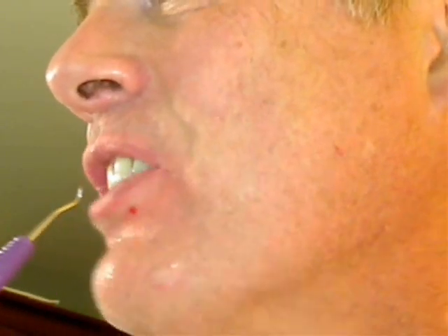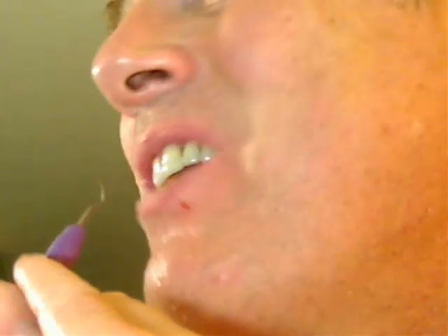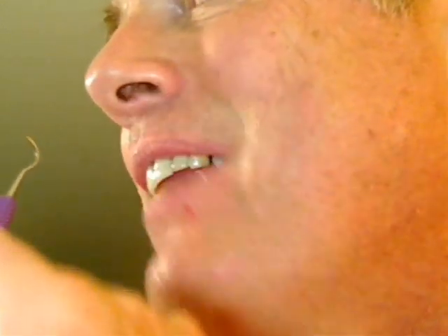I'm working the first molar area, and that was abscessing. I cleared out the abscess largely. Now what I'm trying to do is clean out the tooth in general, go right up to the bone, and then put that tooth on the path to recovery.